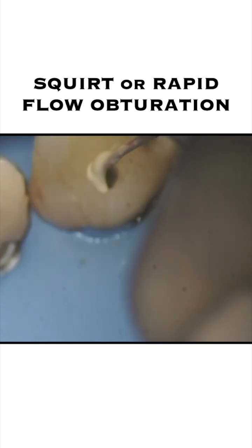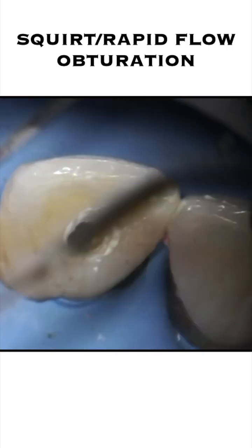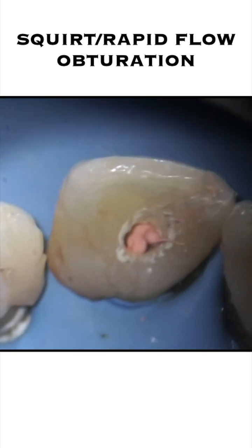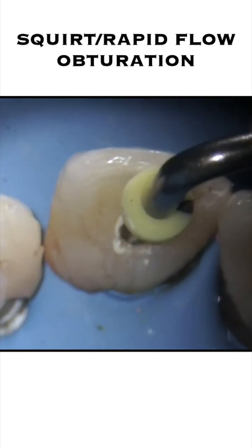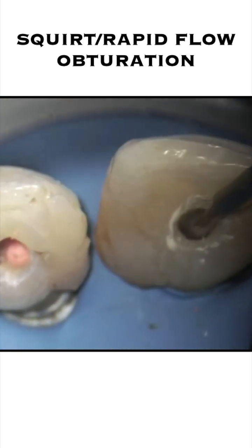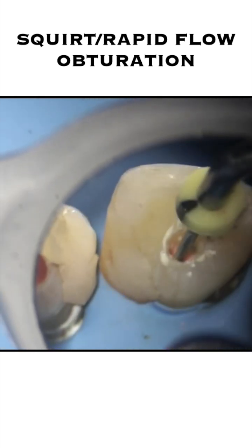Here is a demonstration of the technique. We first place the sealer in the canal, and following this we do not use any gutta-percha master cone — we directly inject the GP. We inject a small amount of GP for the apical third condensation. The GP can even be injected just in the coronal third and then taken to the apical third with the corresponding plugger to get the apical fill first, and following this the rest of the canal is filled in one shot with the injectable GP.